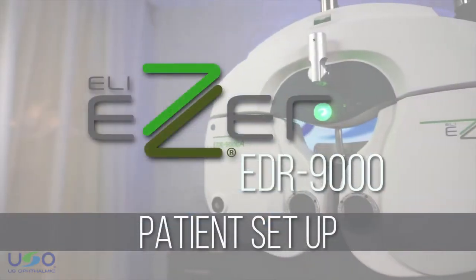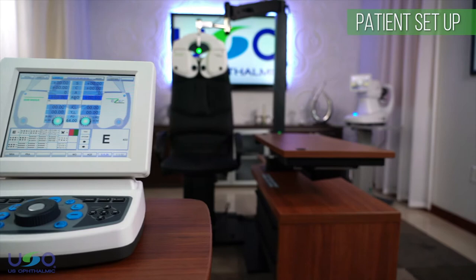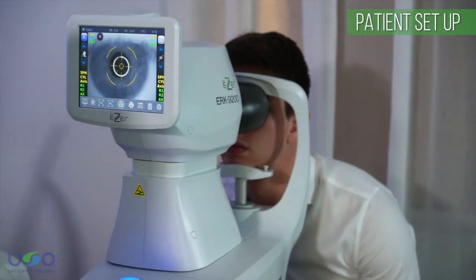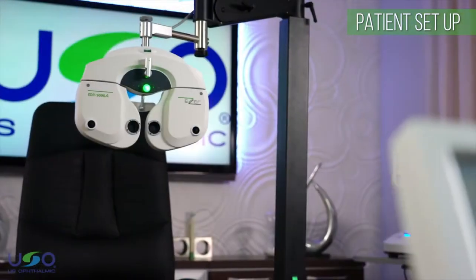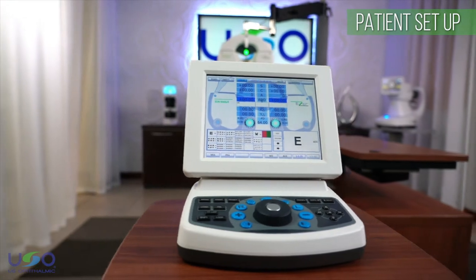Ezer EDR-9000 Patient Setup. The first step to patient setup is loading all the patient's needed information into the digital refractor. You will need the objective refraction performed with the auto refractor as well as the patient's current prescription obtained with the digital lens meter. The print key on each device will automatically transfer the information to the digital refractor.